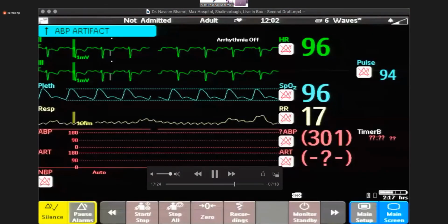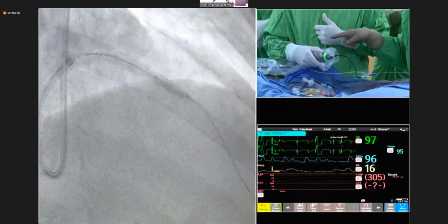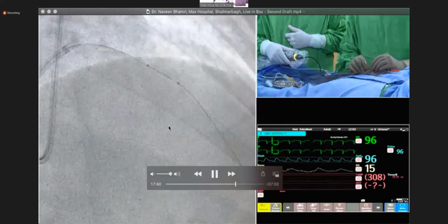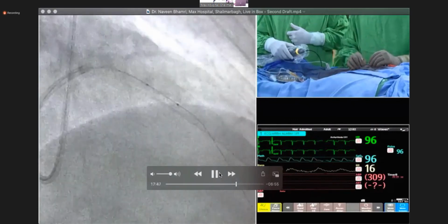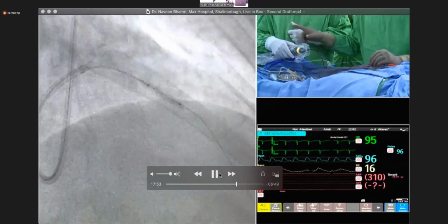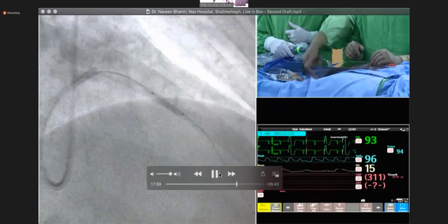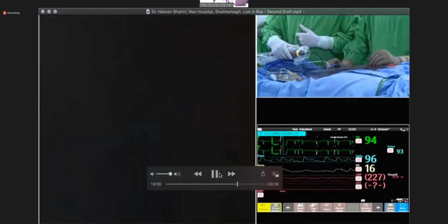So with IVL, we deliver the electrical pulses. You can see in the ECG, there is a ventricular capture because this electrical energy can lead to myocardial stimulation. Store this image. So first pulse given successfully. We'll just move, pulling a little bit proximal. And again, go to 4 atmosphere. 4, sir? Yeah, 4. Okay, start. Ready? Press. 4, 5, 6, 7, 8, 9, 10. Done, sir. And deflate. Store this, deflate.